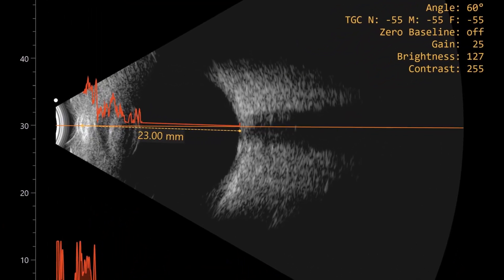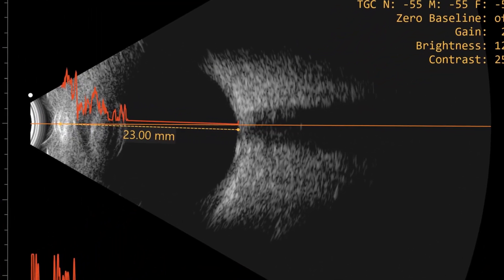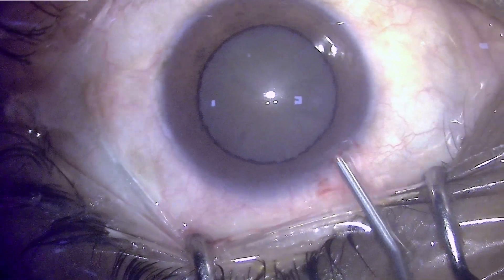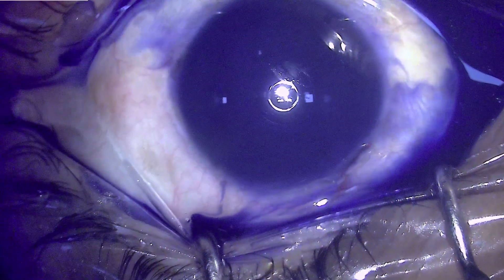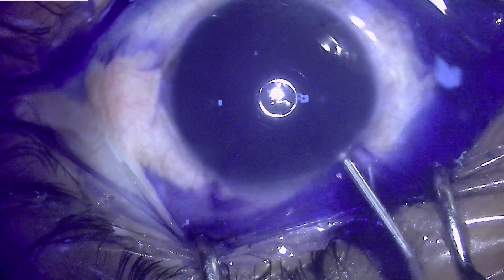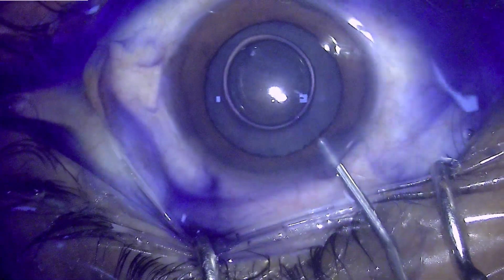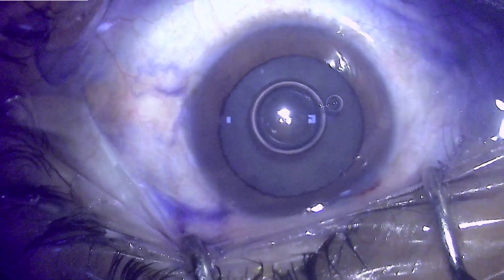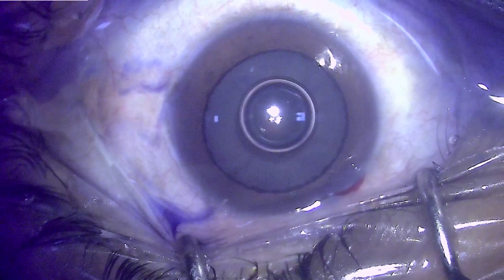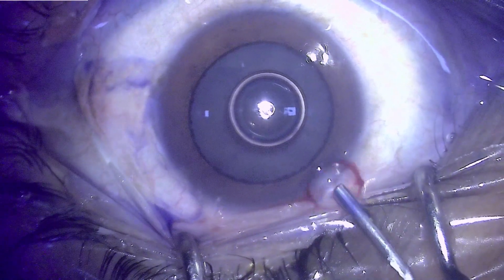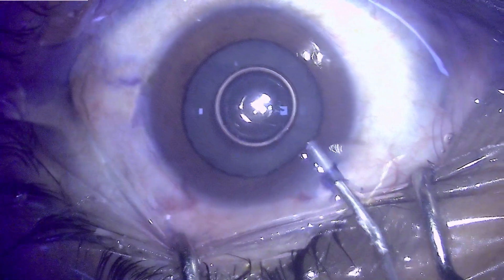These hard nuclei have a problem: during phacoemulsification they require a lot of phaco energy power, and that can cause inflammation in the intraocular tissues, especially the cornea. Here we will talk about power modulation.